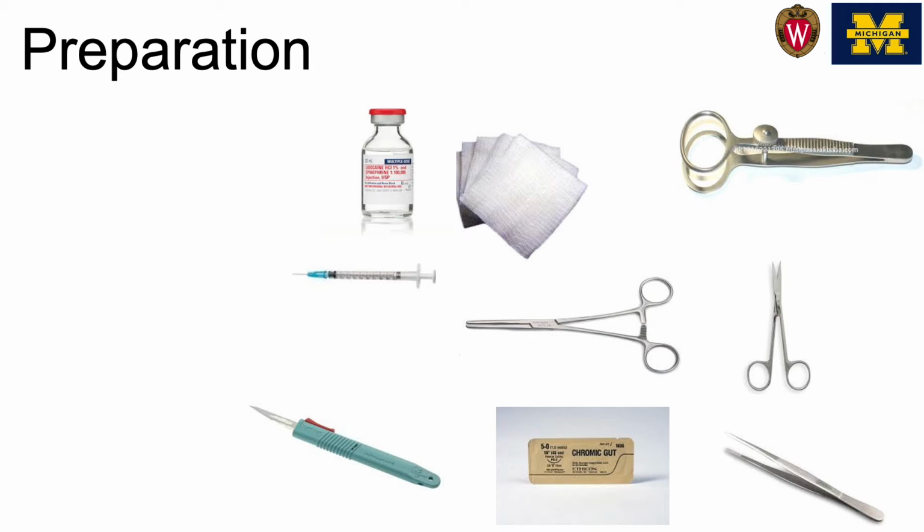Usually I will draw up the lidocaine with epi using an 18 gauge. And then you will inject with what is pictured here, which is a 30 gauge 1/2 inch needle, lidocaine 1 to 100,000 epinephrine. And then I always have several gauze available to sort of ensure that the visual field is clear at all times. And then on the upper right-hand corner, you see a chalazion clamp.